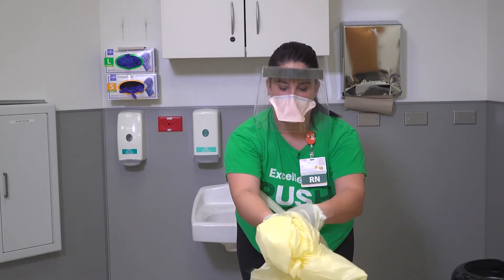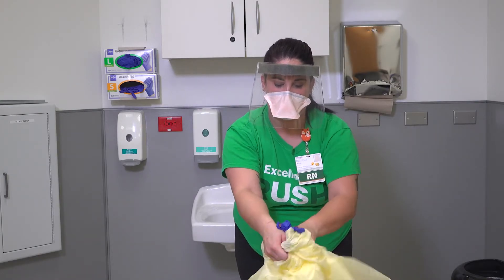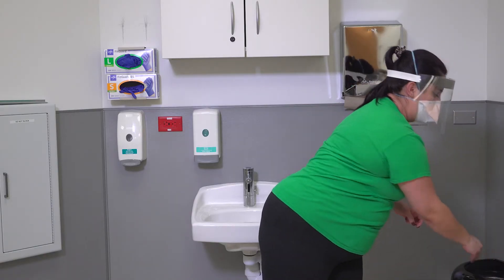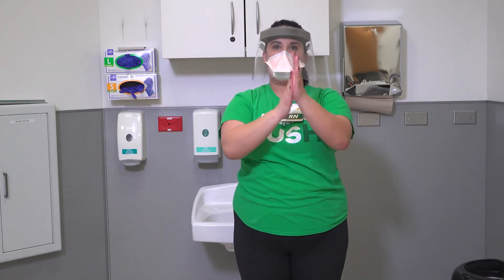Then lean forward and firmly pull the gown away from your body, breaking the tie at the neck. While removing the gown, roll the gown inside out into a bundle. As you are removing the gown, remove your gloves at the same time, only touching the inside of the gloves and gown with your bare hands. Place the gown and gloves into a waste container and perform hand hygiene.